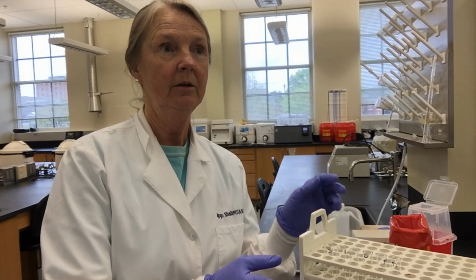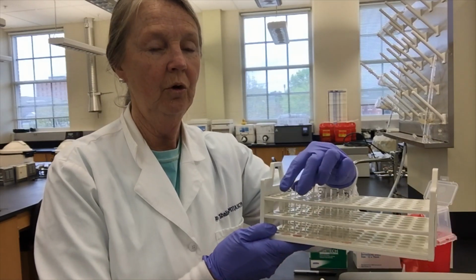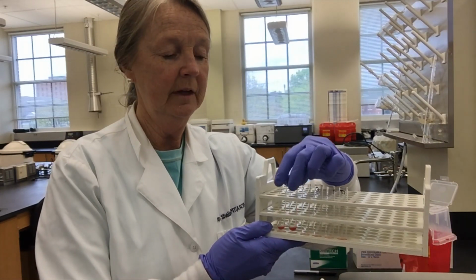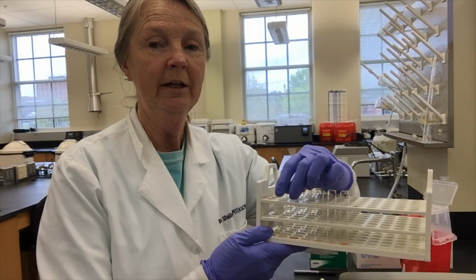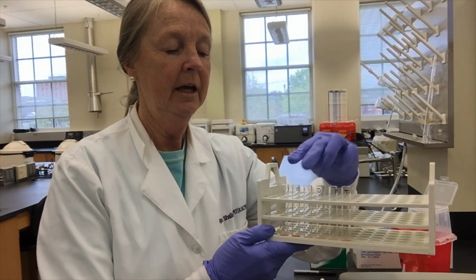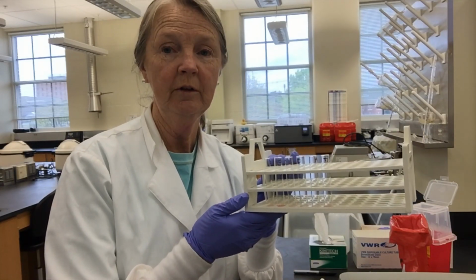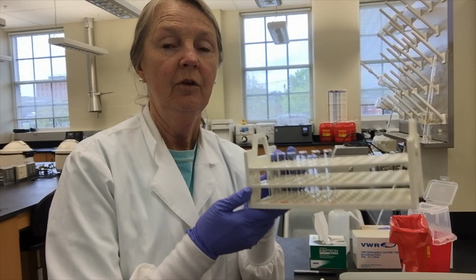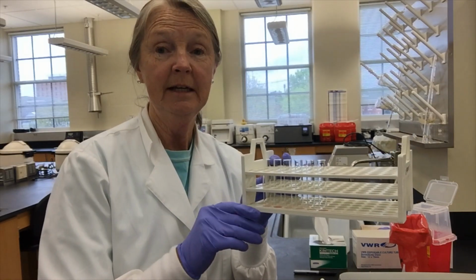Okay, good morning. I am recreating the DAT IAT lab procedures. So the very first step is to receive your sample unknowns. I have given you 6, A, B, C, D, E, F, that you will need to write down the reactions for. And right now the first thing that I'm supposed to do, and that I'm going to do, is wash these cells completely so that I can take 1 drop of that and complete my DAT procedure.